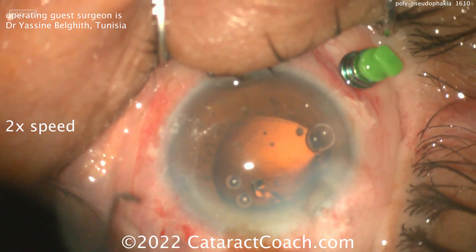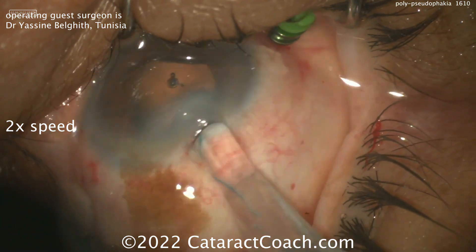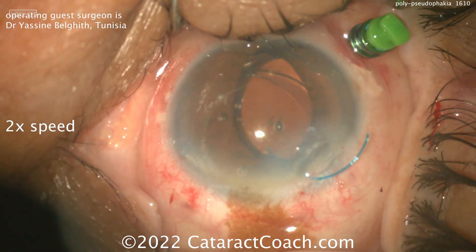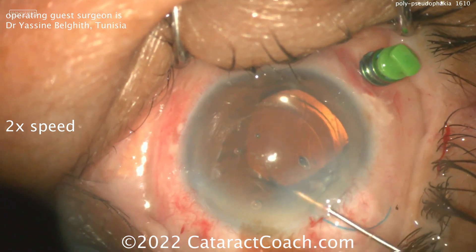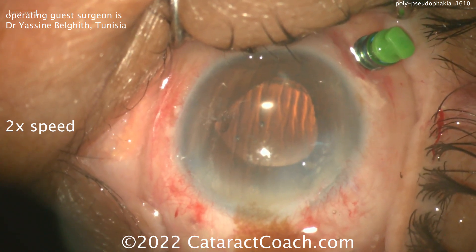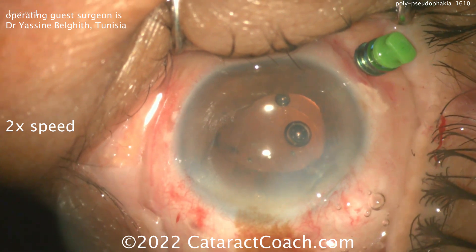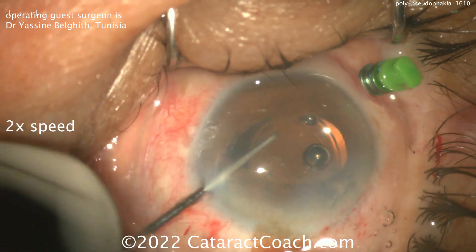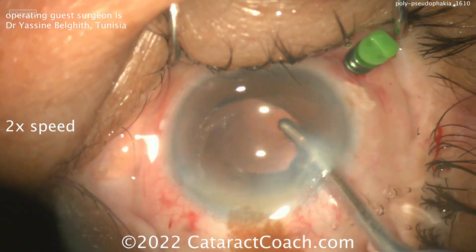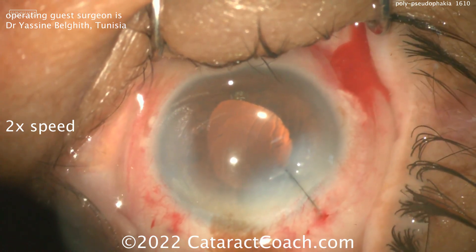If needed, you can always go back and do a secondary surgery — place a secondary IOL in the sulcus based on the post-operative refraction — and you may get a more accurate result than doing primary polypseudophagia. In this beautiful case, you can see it's been done very nicely; a second IOL is going inside the eye, appearing to be in the ciliary sulcus, and this patient will have a very nice outcome. But my advice for the USA is different: put in a 40-diopter single-piece monofocal acrylic lens in the capsular bag — FDA approved — then wait and see. My guess is the patient will already be pretty happy.